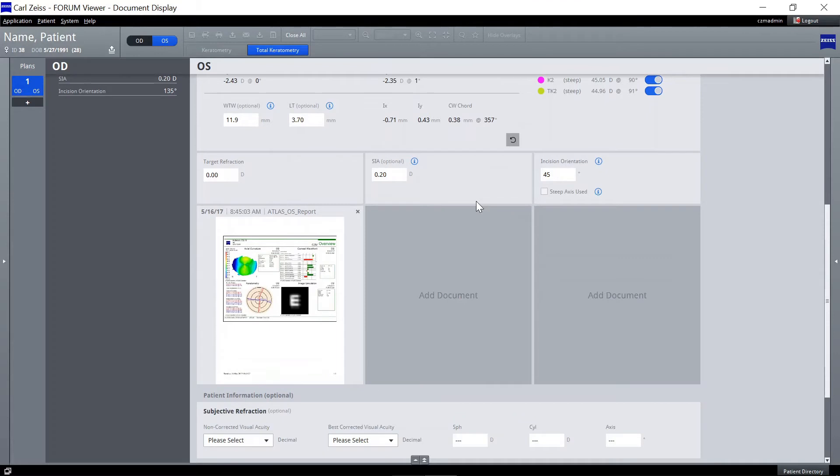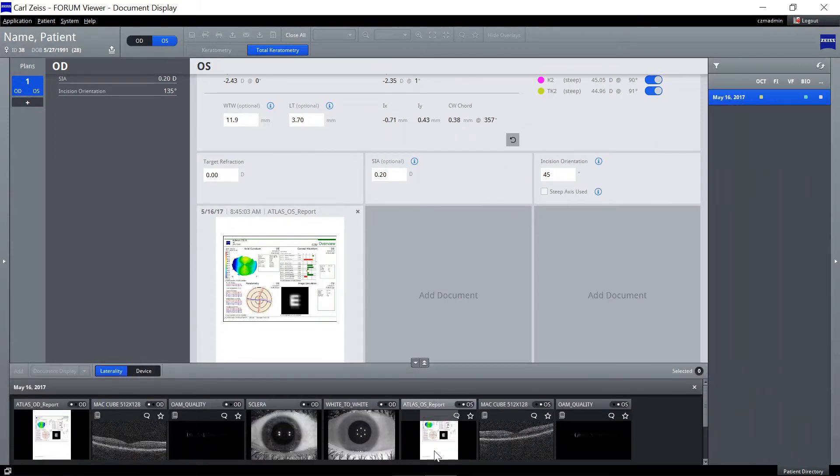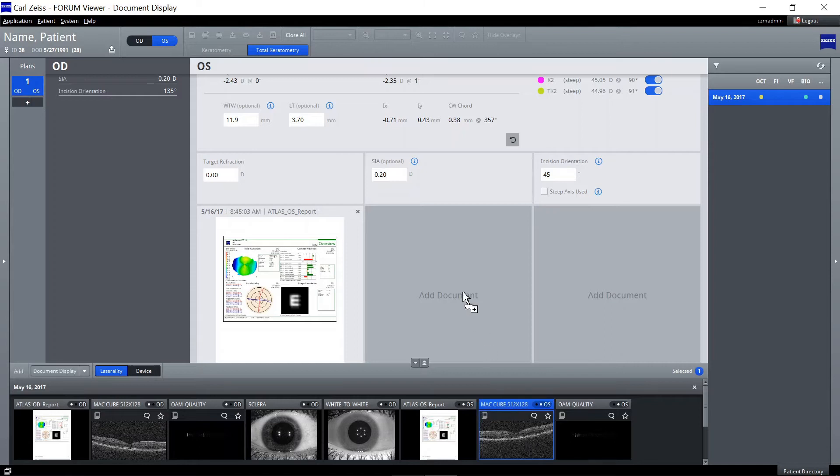Other available documents can be dragged and dropped from the thumbnail gallery to the document bar by double-clicking on a document. The document will open in the full-screen view.